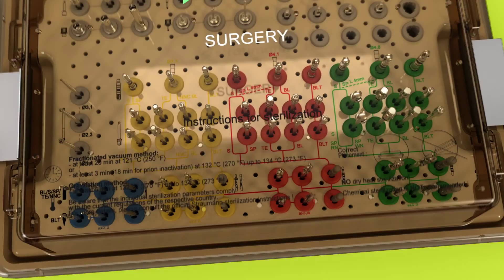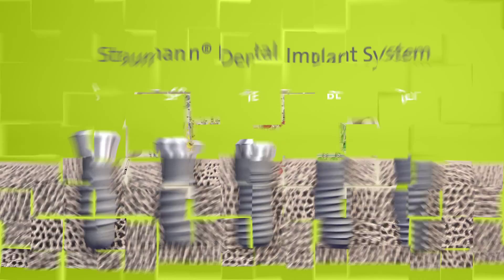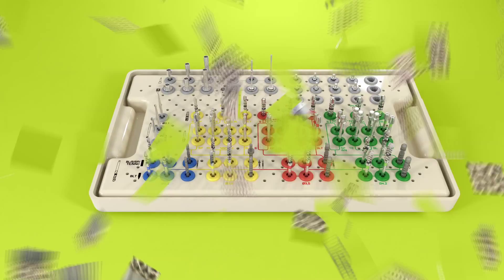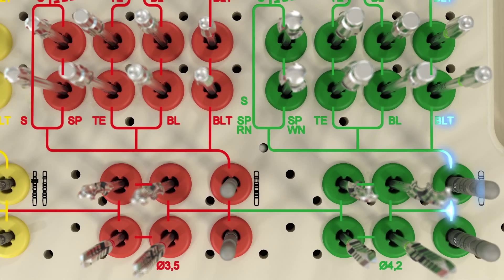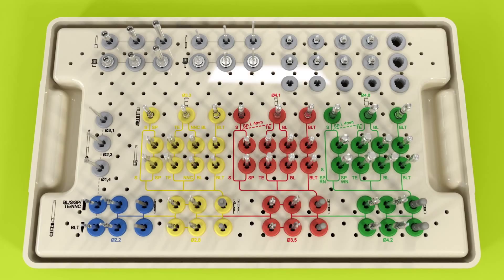This presentation demonstrates how to use the Straumann Surgical Cassette. The Surgical Cassette is designed for secure storage and sterilization of the surgical instruments and auxiliary parts of the Straumann Dental Implant System. It follows a simple layout with color-coded application pathways, which represent the workflow lines that guide the user through the surgical procedure. The cassette layout is convenient for all the instruments needed for the implantation process.